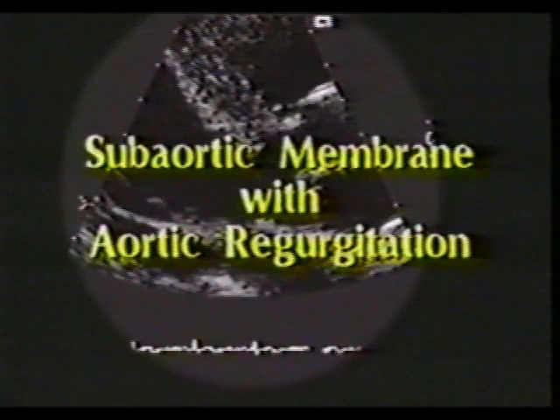Discrete subaortic stenosis can either be membranous or fibromuscular. This is the magnified long-axis view of a 49-year-old patient with discrete subaortic membrane. Here is the aortic valve, and in this frozen frame you can clearly visualize the membrane in the subaortic position, resulting in left ventricular outflow tract obstruction. Visualize this in real time now.